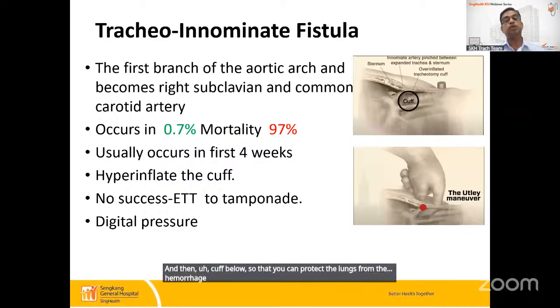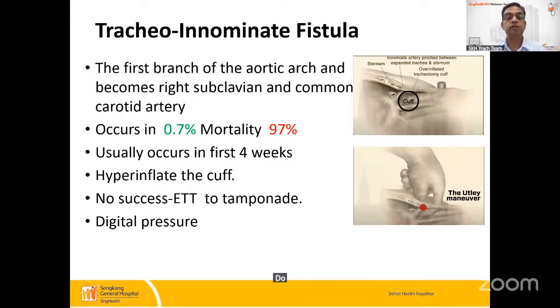The other thing you can do is while you are ventilating the patient from above, you can put your small finger into the stoma and then just do this Utley maneuver, which can help stop the bleed while you are getting your help.